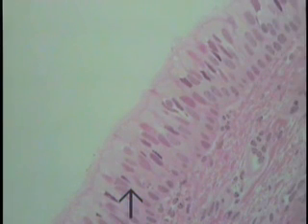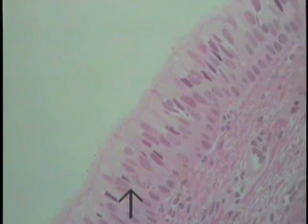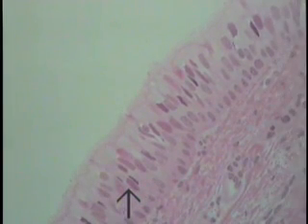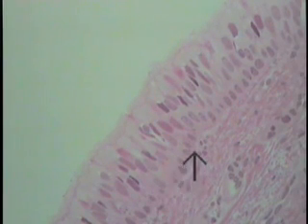This is another section of trachea to illustrate the ciliated pseudostratified columnar epithelium, but with a plastic section, so the resolution is much crisper and the preservation looks much nicer. So this is the epithelial surface extending from where the tip of the arrow indicates to that little thin basement membrane that's being traced by the tip of the pointer.